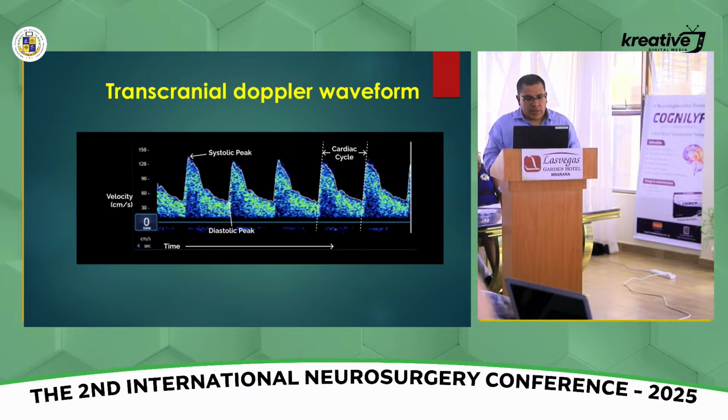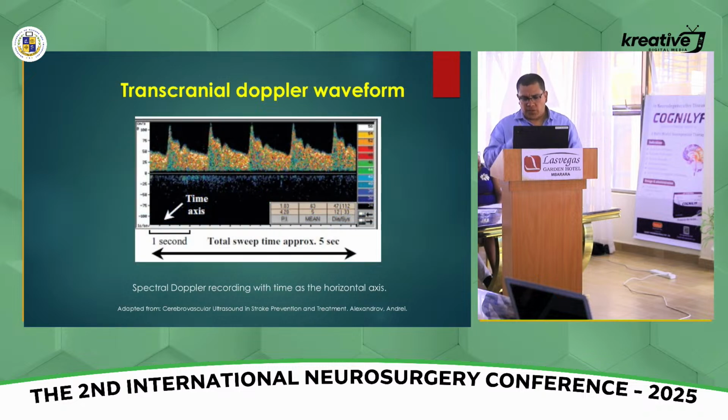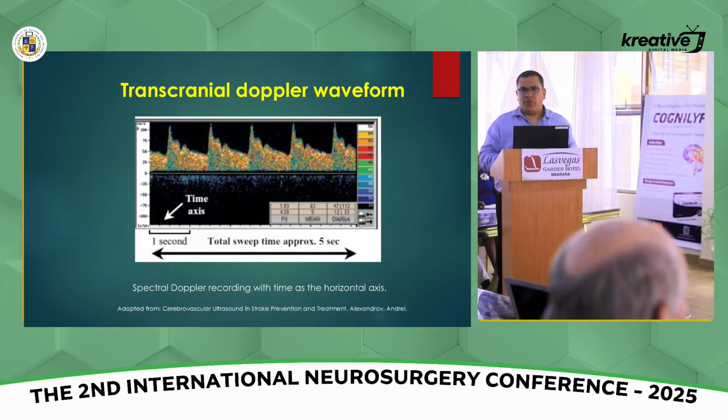This is another example, and that's basically going to tell you the direction of the flow. I don't know if the ultrasound machine here has it, it depends a lot on the software also. I don't know if we'll be able to have the software, but we can work on achieving that as our relationship continues. So basically, above that line means that the flow is coming towards you. And if the waveforms were in the bottom, this basically means that the flow is going away from you.